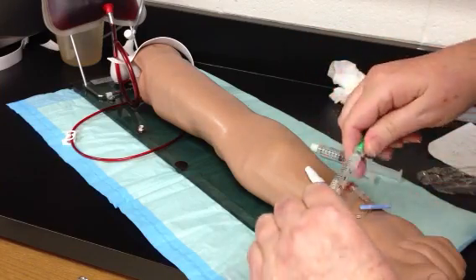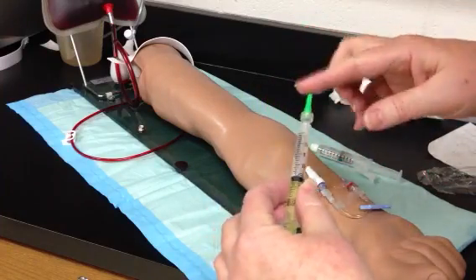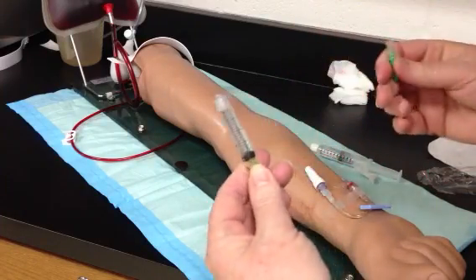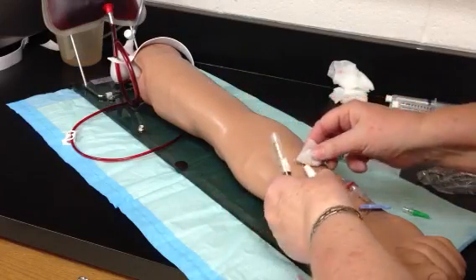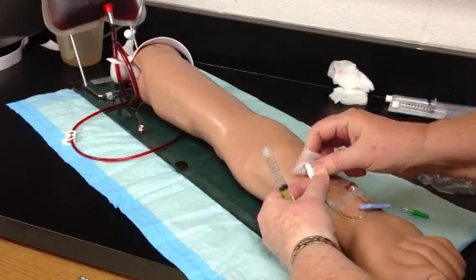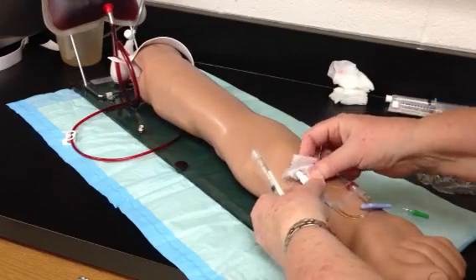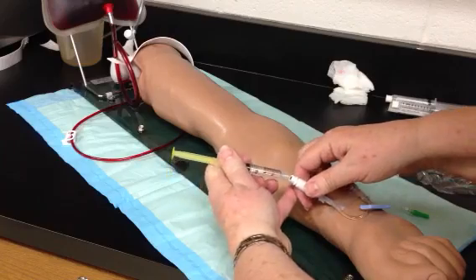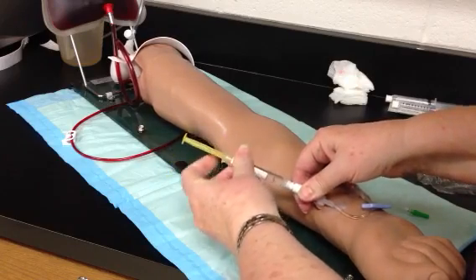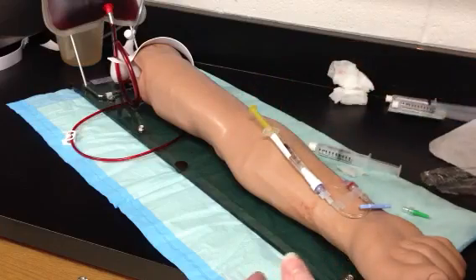And then I just picked up some type of a tip to put on this, but I'll take it off completely. I wanted to maintain sterility of it. I might re-cleanse if this has been out of my line of sight, if the patient might have moved or coughed on it, or anything might have happened to have contaminated it. And then I'm ready to push my medication.